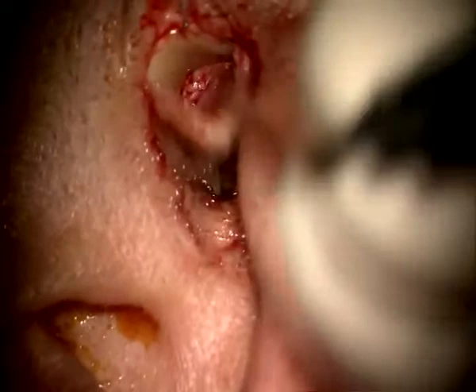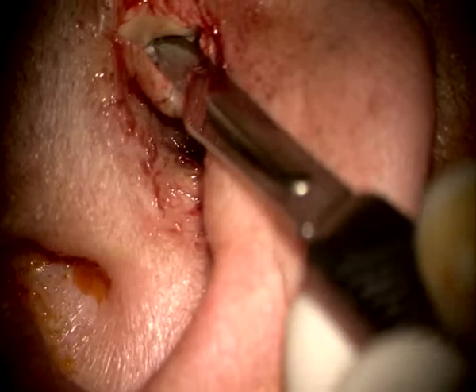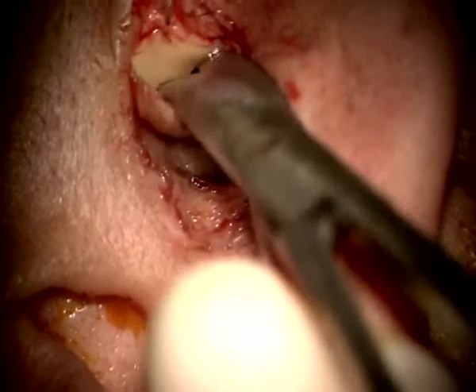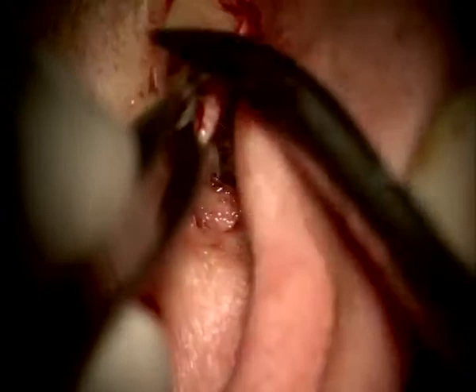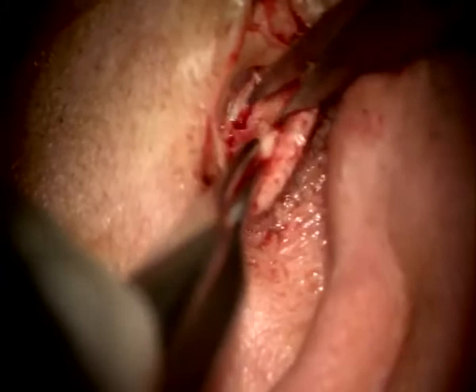I also want to take a piece of composite cartilage. Give me a knife. Leave again a rim of tissue so as not to distort the ear. So that's superiorly. Give me a tip with a skin hook. And we cut, bisect, and take it out. Put it in saline. Can I have the skin hook? Put the skin hook on, please.